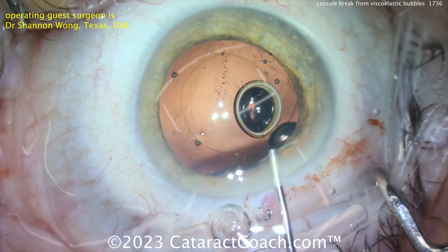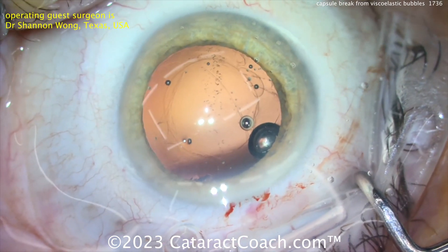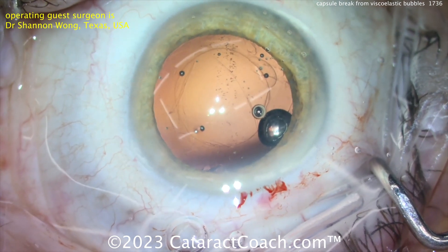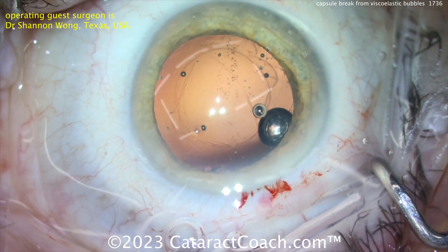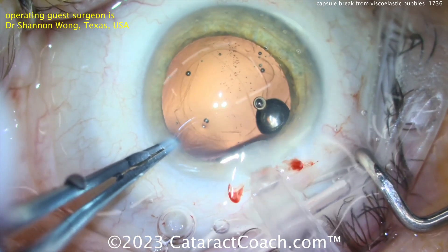With a very nice-looking rhexis visible, in this case a three-piece lens can be used with regular optic capture — meaning the haptics go above the capsule into the sulcus, and the optic goes behind the capsule rhexis to be captured in place. Here comes the lens, which looks like a three-piece silicone lens.